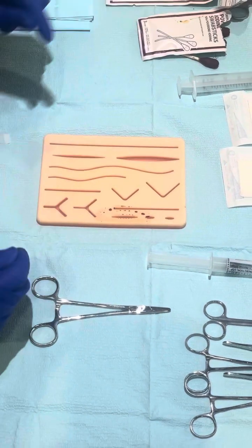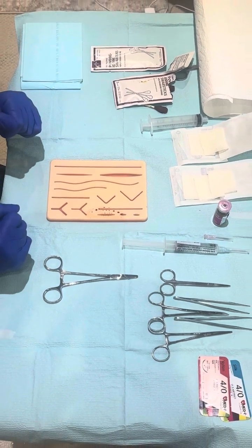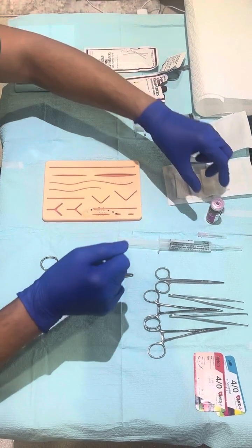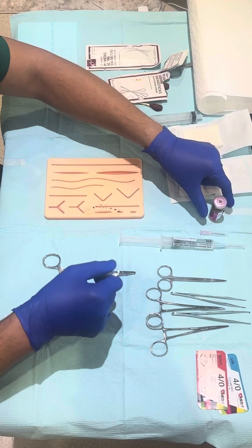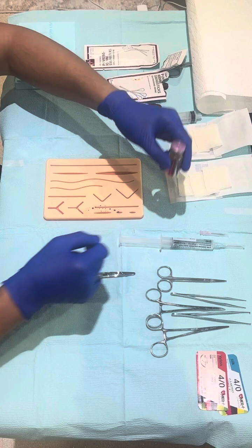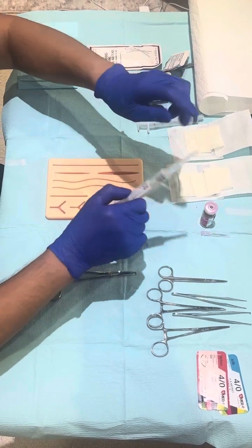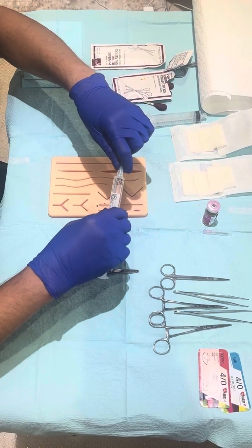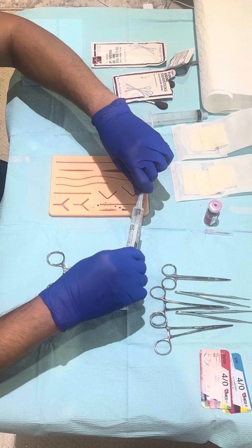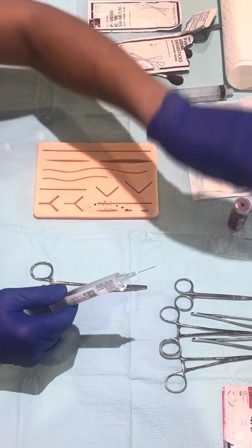After the wound is clean, you are now going to introduce the local anesthesia. Usually we use lidocaine, either 1% or 2%. When you get lidocaine from the vial, you use an 18 gauge needle to extract it. After extracting the lidocaine, you will normally use a gauge 25 needle to inject the anesthesia into the patient's wound or skin. This is the gauge 25 needle.